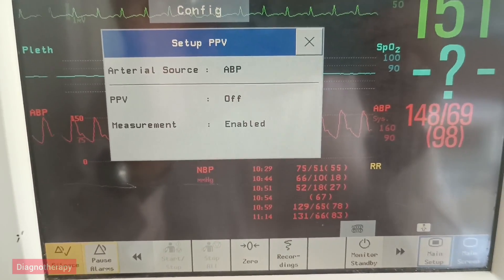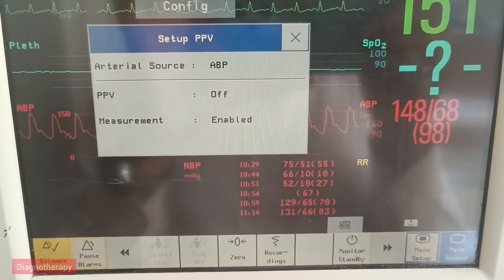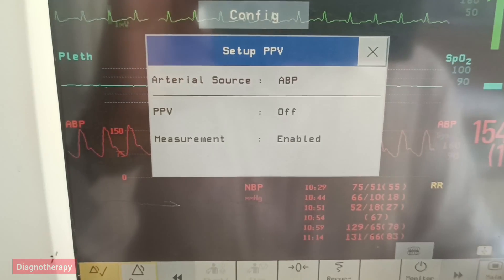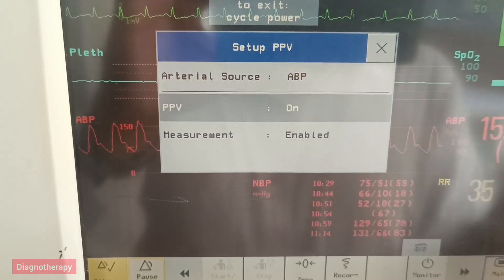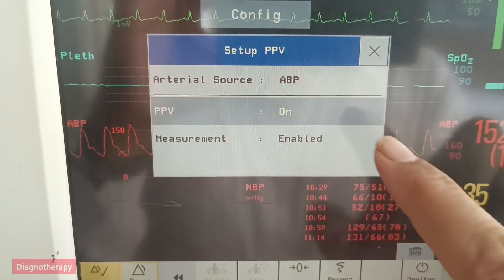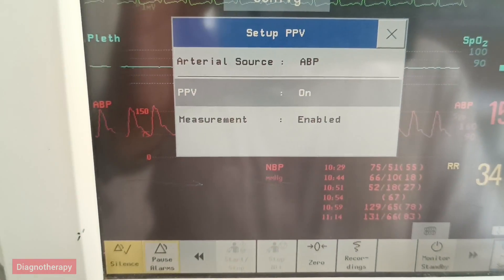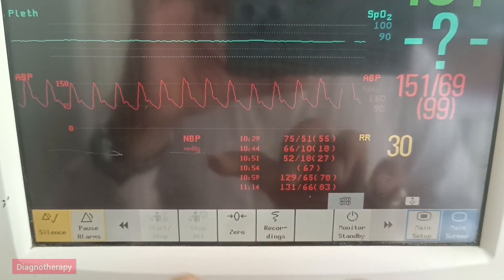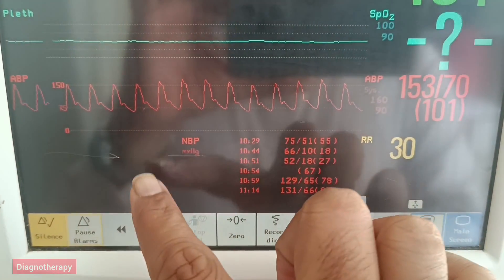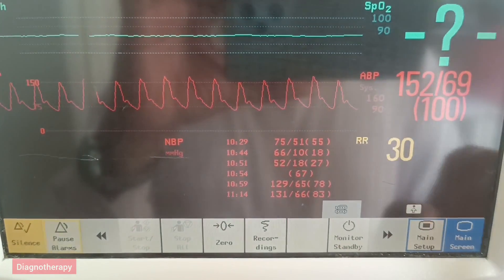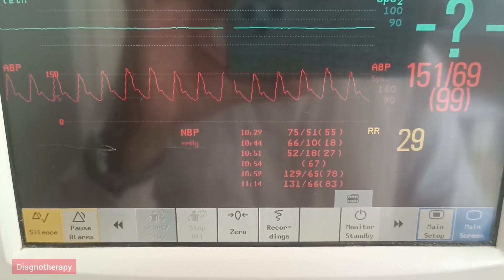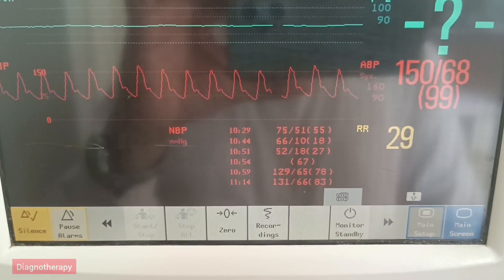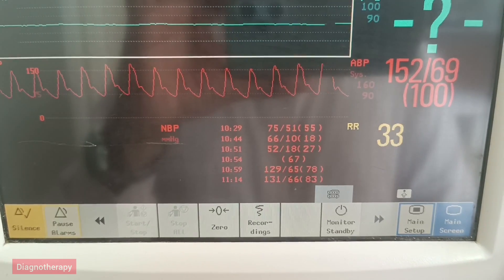Now scroll down further and select PPV off. The monitor has started PPV. Now you want to start the display, so select on, and then you need to find a blank space where you need to have the value.